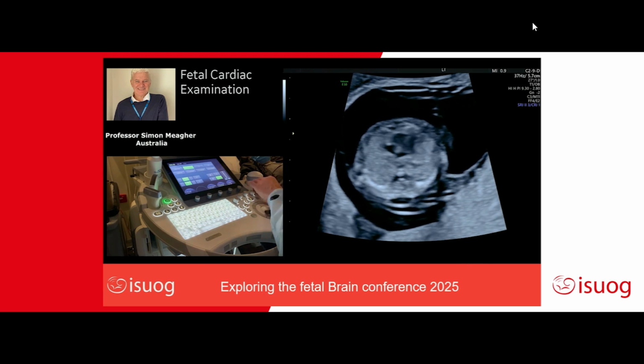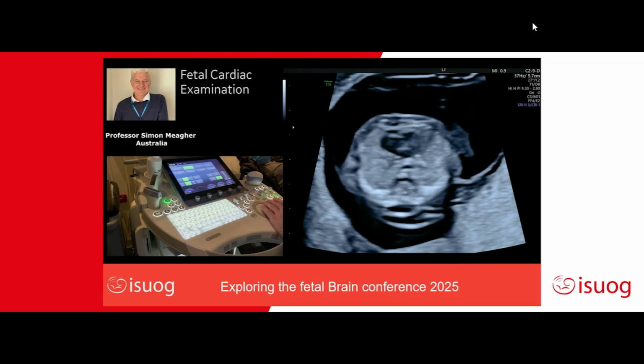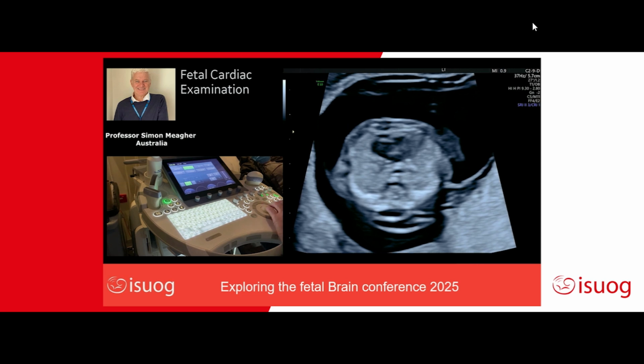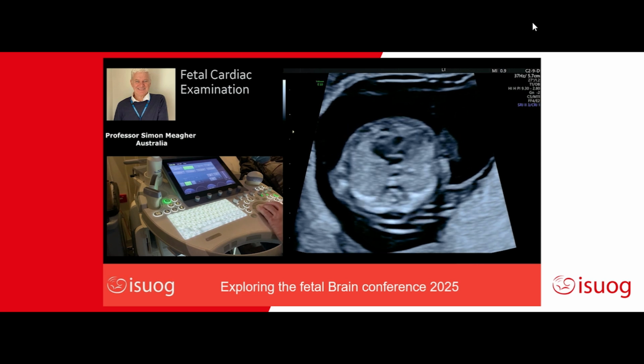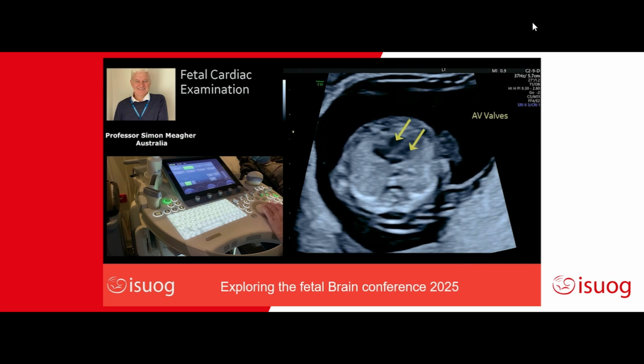You can then see, once you magnify this image, a little bit more dynamic range, because what you want to see is the normal movements of the atrioventricular valves. So if we can cine loop, just go through that. Just press the cine and run through it. You see the movement of the atrioventricular valves in 2 cardiac cycles, and they appear normal.